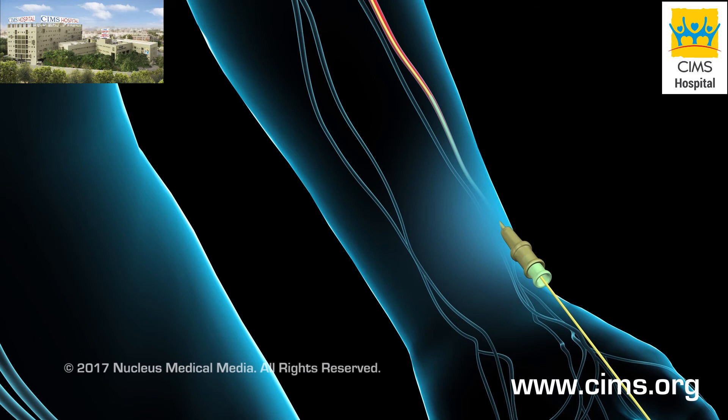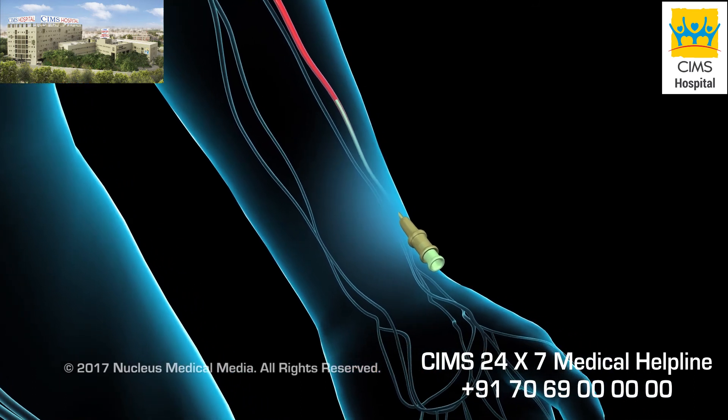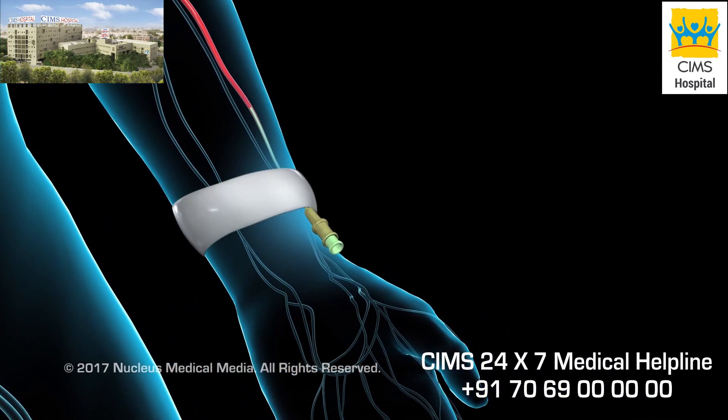At the end of the procedure, the catheter will be removed through your wrist. A pressure band will be used over the radial artery to prevent bleeding. Then, the sheath will be removed. The pressure band will remain on your wrist until bleeding has stopped. To find out more about coronary angiography, talk to your health care provider.